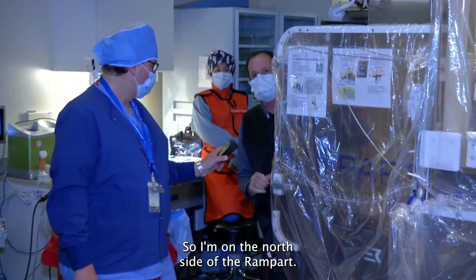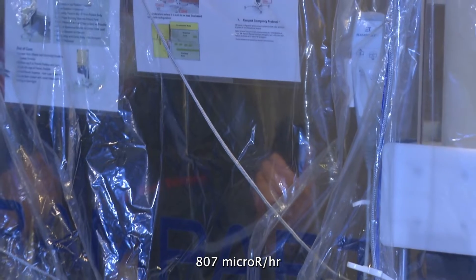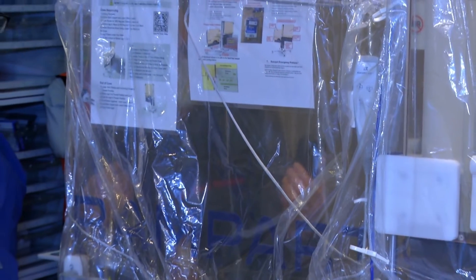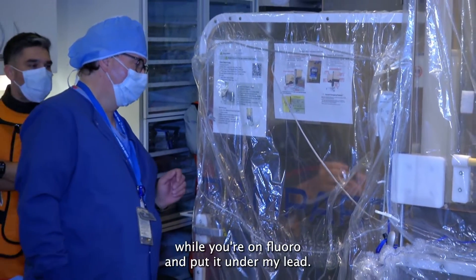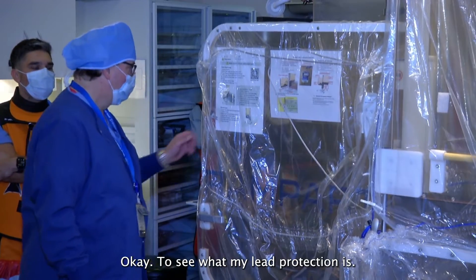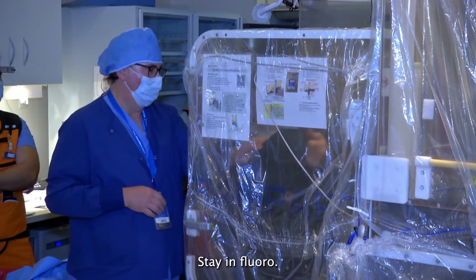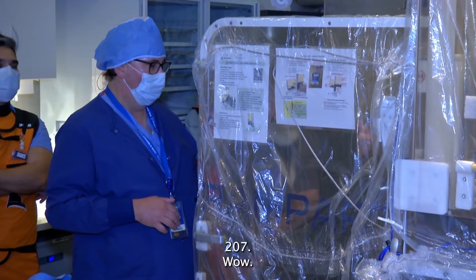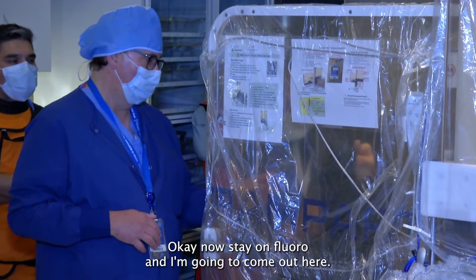I'm on the north side of the rampart. While I'm on fluoroscopy, it's reading about 807 micro R per hour — 750 to 800 depending on how I hold it. Now I'm going to take it and put it under my lead to see what my lead protection is. While I stay on fluoroscopy, it's reading 207. That's behind my lead.